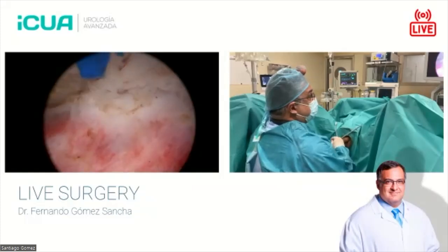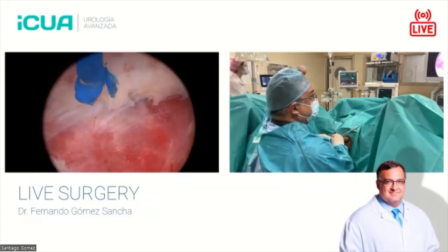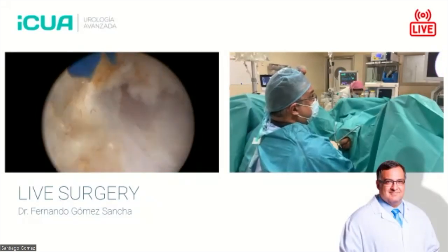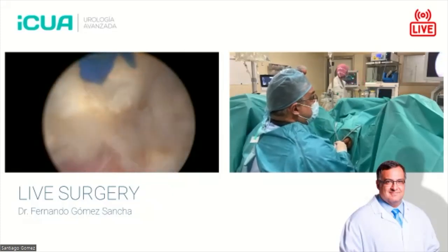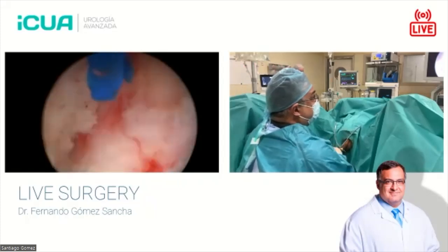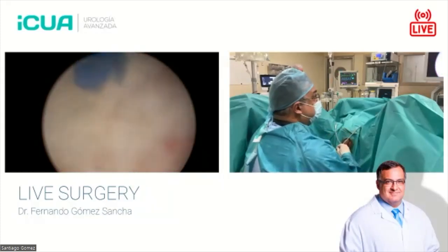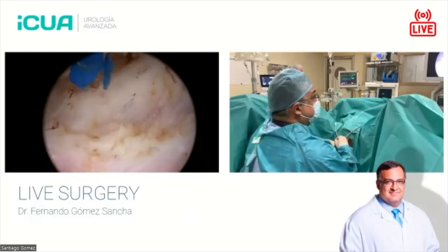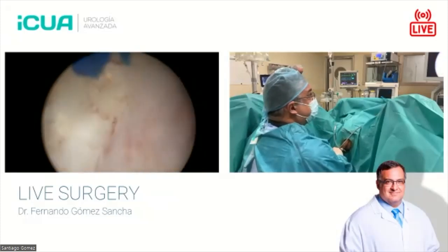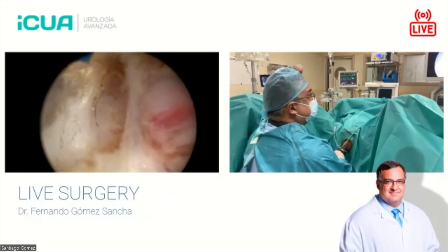Here I'm going to the posterior aspect. And here, of course, is where the aiming gets very important. You see, the plane is a little bit flimsy, a little bit thin. So I need to keep my fiber close to the upper side, close to the adenoma, like the motorbike driver taking the curve. I need to tilt towards the adenoma and see if I can progress in this plane without deepening in the capsule. The capsule is very thin, so I keep my laser up. I don't fire here, I fire up there. That will disrupt the fibers that are joining the adenoma and the capsule, but I will try not to penetrate the capsule. And this is almost finished now.